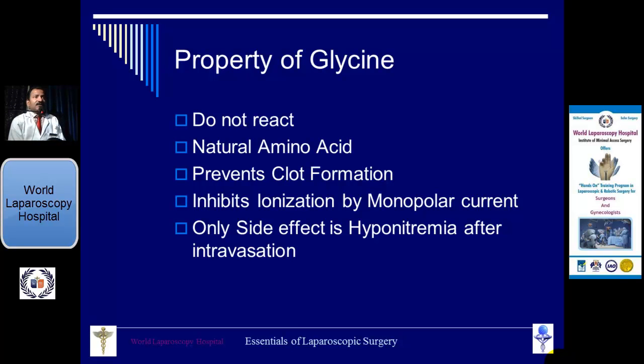Isn't it? So that's why generally you should have a good fluid insufflator, known as Endomat. Here you are seeing that we are using a Medex pump, but you can use the fluid insufflator for hysteroscopy. It has a calculation for the fluid input and fluid output, how much you have used. It will tell you at the end of surgery. But that also is not very useful.